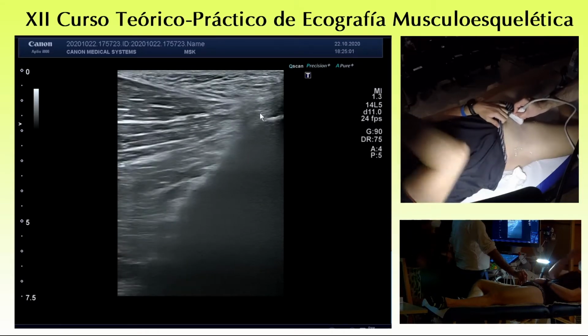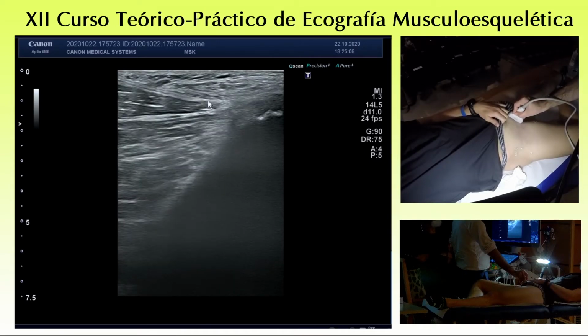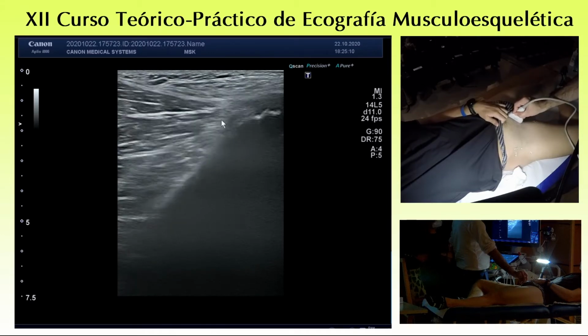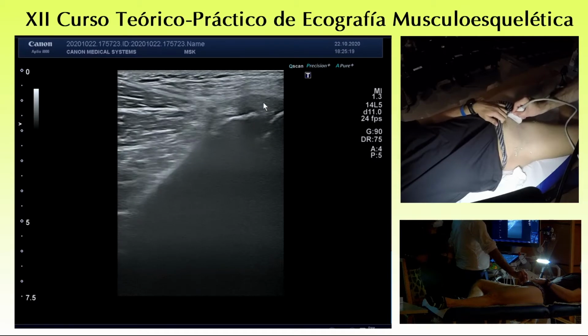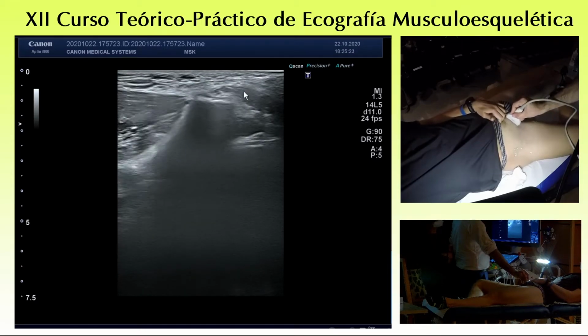The other components of the tendon don't have much here. The other tendons have more muscular attachment, the brevis and the magnus, and the most tendinous part is from the adductor longus. And then, of course, there is the aponeurosis of the rectus abdominis and pyramidalis just here.